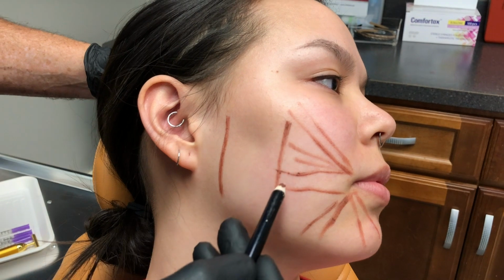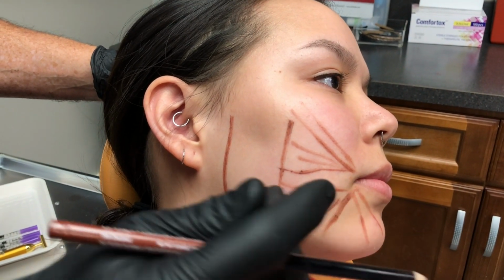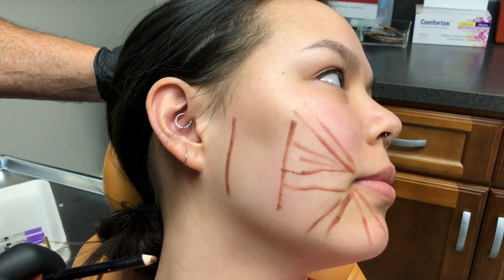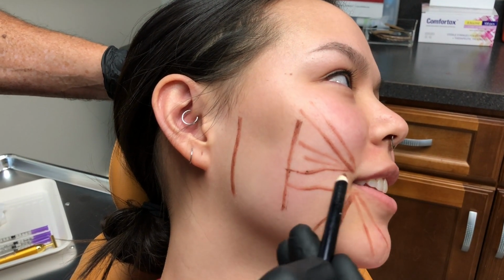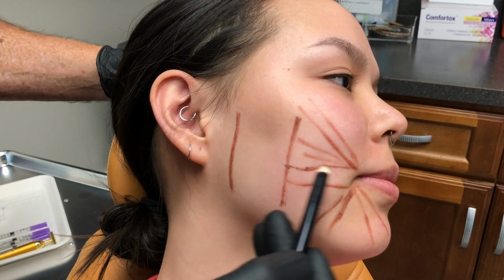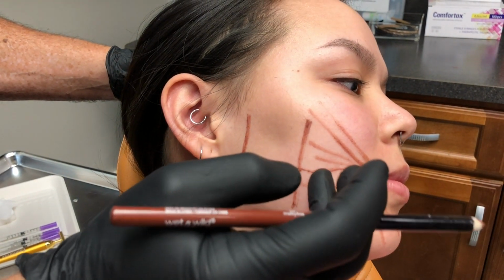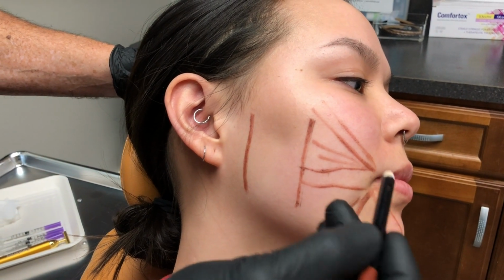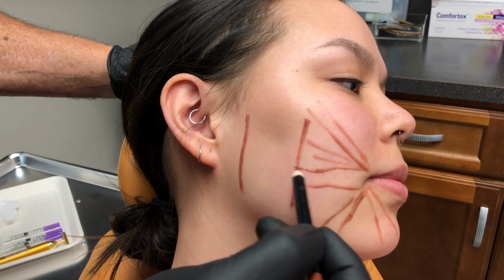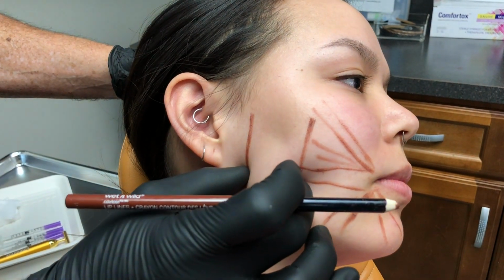If I take out any of these muscles that I shouldn't take out, when she goes back and smiles, you can smile for everybody, the corner of her mouth goes up, it goes back, but if I take out this muscle especially that draws it straight back, it will look like she's got a Bell's palsy if Botox gets to this muscle, or she's had a stroke, which we don't wish on anybody. So you want to really make sure that you are in the muscle that you're targeting.